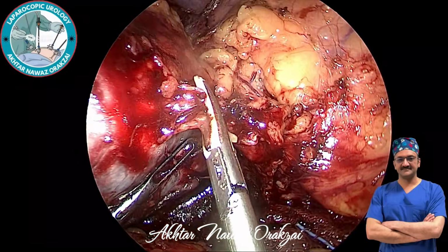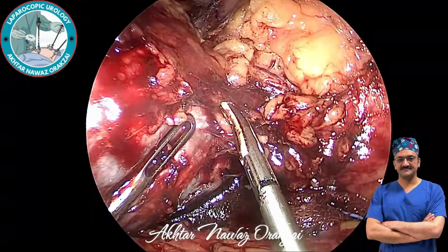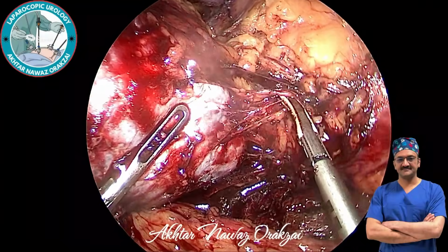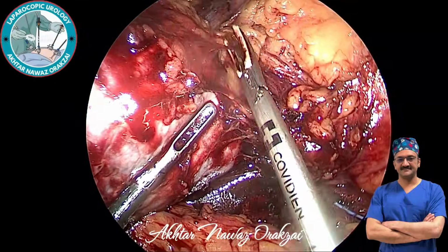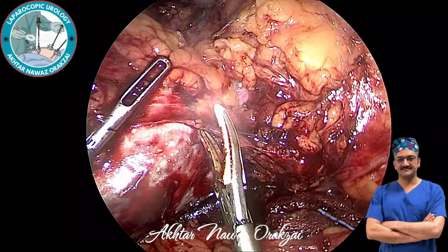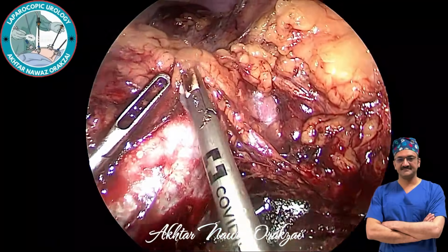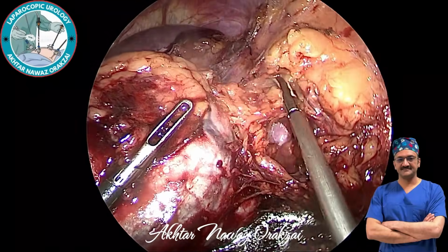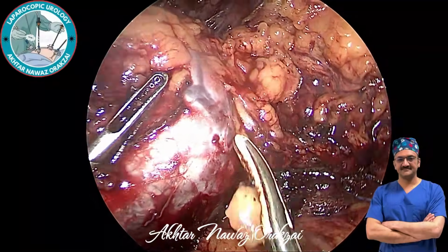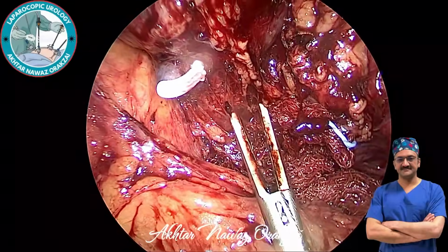So this was the branch. So we sealed it with ligashore. Ligashore can seal vessels of up to 7 millimeter of diameter. This is the parenchyma of the upper pole, and the artery is pulsating. So you can use a small clip, or you can use a bipolar forceps, or you can use a ligashore.